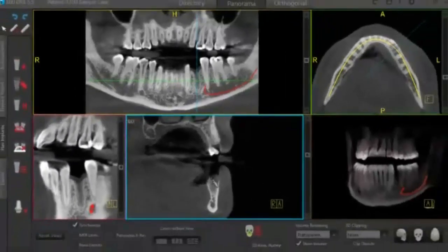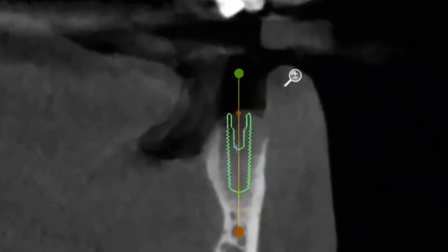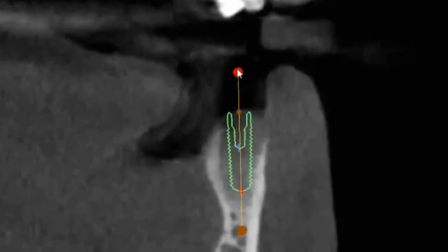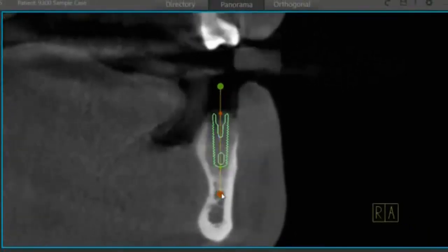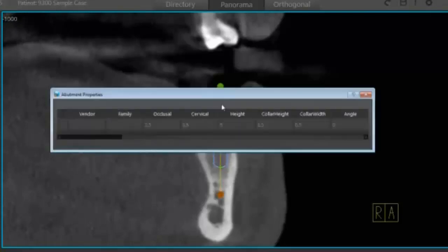I'll select and start by dropping the implant into my cross section. From here it's very easy to move the implant around — I can left click and move it bodily, or grab its occlusal anchor point. You can see how easily it moves on the anchor points. I can roll through my slices and also throw an abutment on and make changes to the abutment as well.